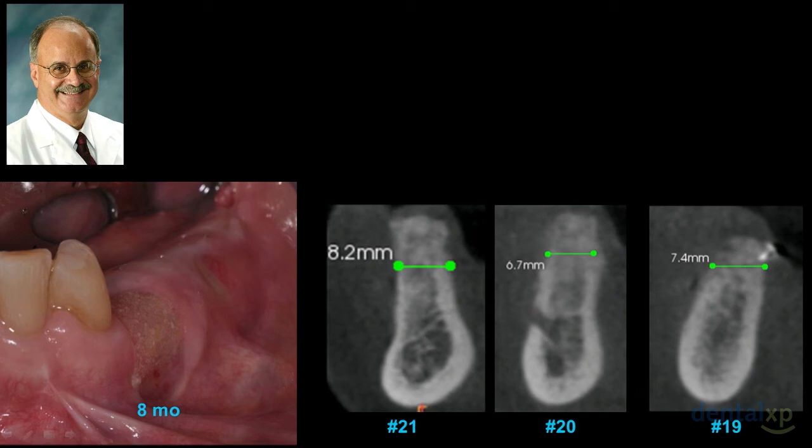That's from doing literature searches and seeing how that particular material works over the years. In our hands now, we're under 10%, doing a number of procedures up front to increase tissue thickness and different flap techniques. We've minimized the exposure, but Ti mesh is way more kind to exposure than this material. This material will literally, as you see here, cause loss of tissue volume. And it's not fun to have to flap these and get creative with flap design, and then also secondarily have to soft tissue graft to make up what volume loss we've had.